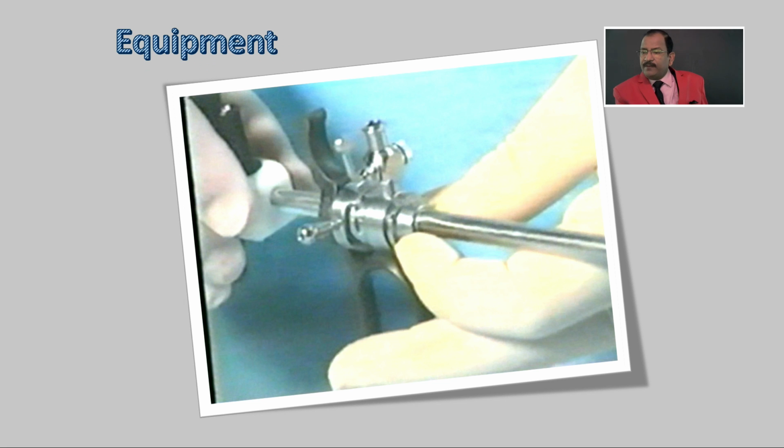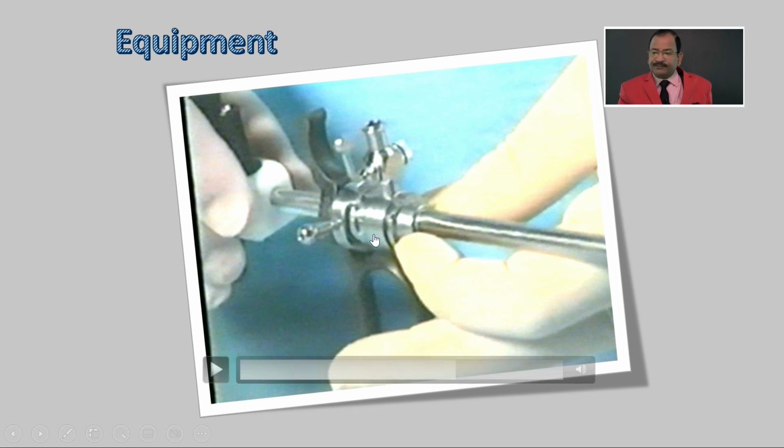So, this is to attach with the Medex pump or endomat or hysteromat. There are different types of irrigation machines. Some people directly put in the bottle and they have a needle and pump to push the gas into the bottle, but that is not a good technique.